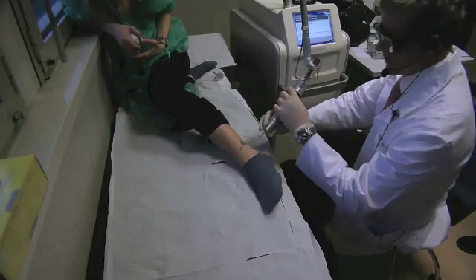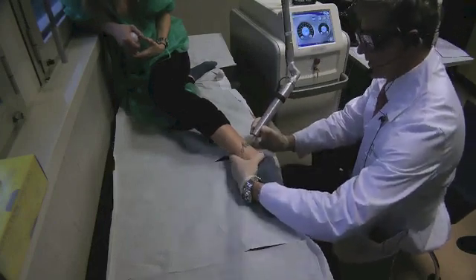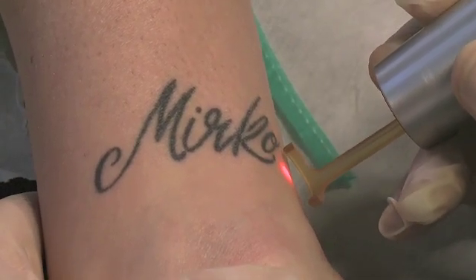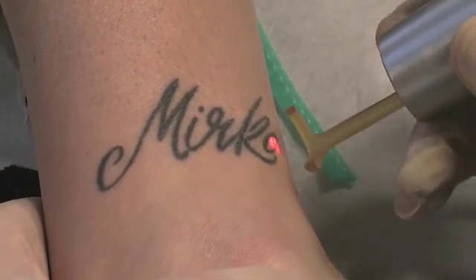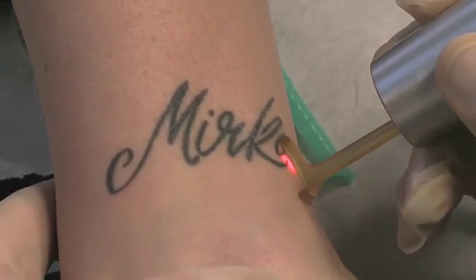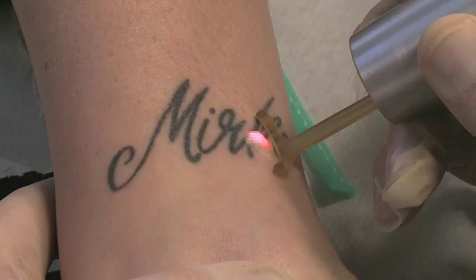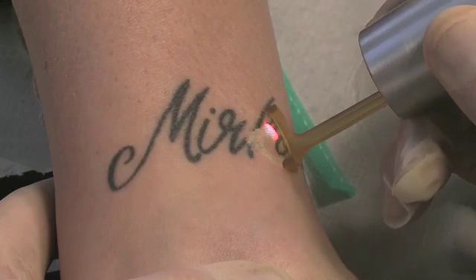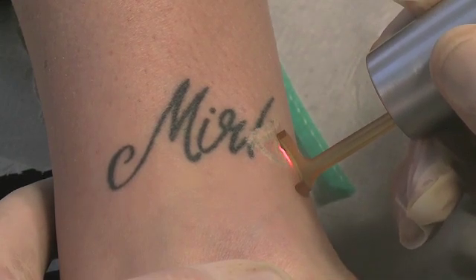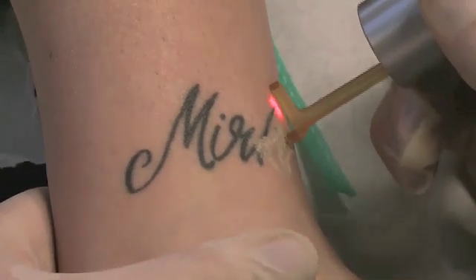We see here the ankle of a young lady who wants to get this name removed. We have the dual wavelength laser ready for treatment. We have selected a wavelength of 1064 nanometer. We can easily choose the fluence per square centimeter with a touch screen — we select 1.90 joule per square centimeter — and we also choose the repetition rate, which we select at 3 Hz. Everybody has goggles on. We want to start the treatment now. The laser is ready.